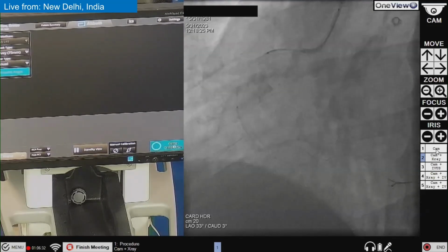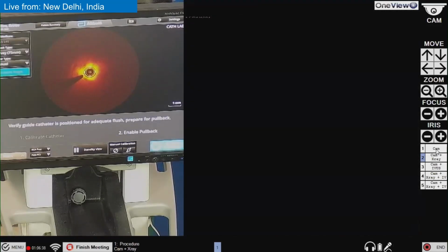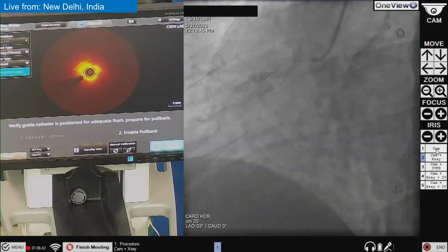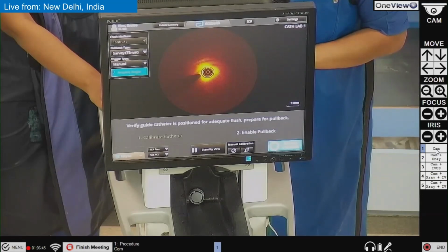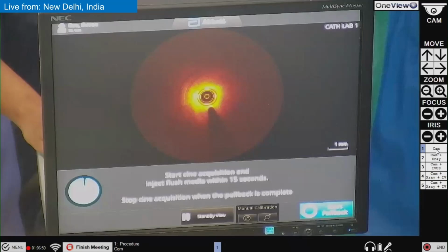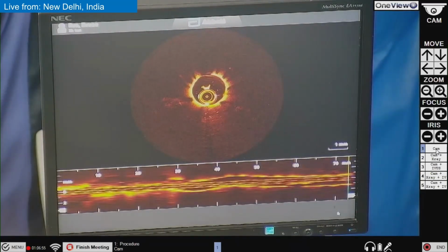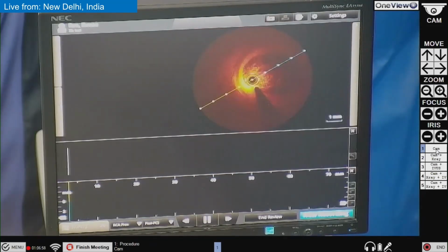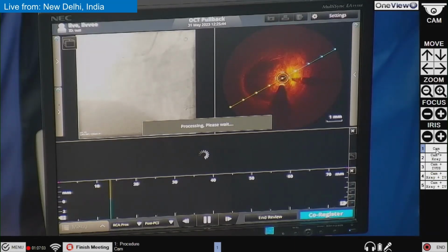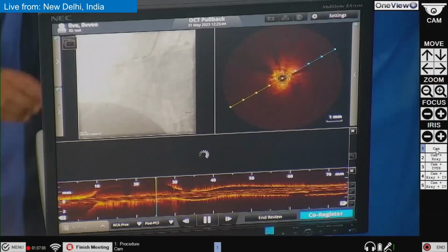Okay. So I'll put it a little bit back. Okay, fine. Slightly more. Because this will take some time to clear, so we need some extra knowledge. The guide has come back. No, it's okay. Looks all right. Not as good as we wanted. Yeah, so we can do one more.